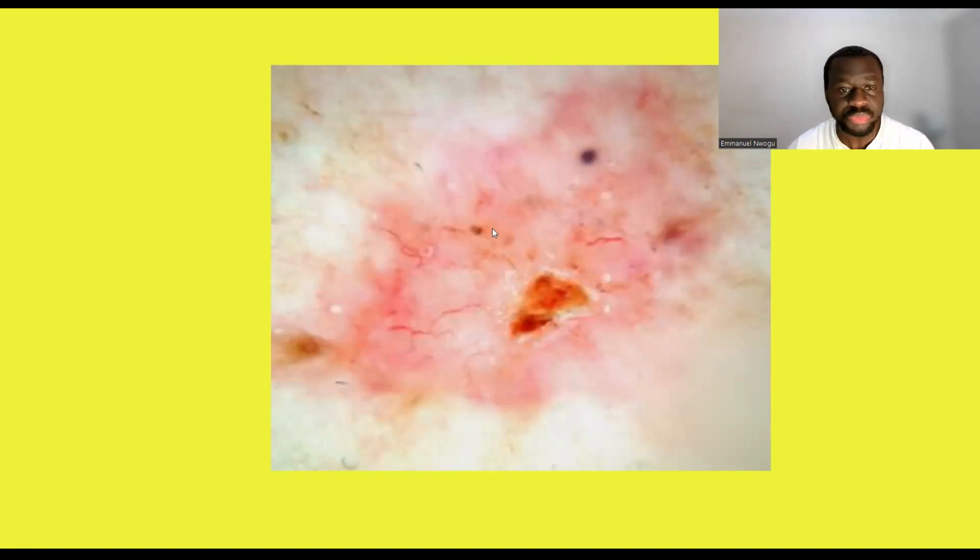Excuse me. This other lesion shows you ulceration. That's a blood clot. That's an ulcerated part of the lesion. You can see so many arborizing, branching blood vessels. You can see this whitish area around, telling you there's ongoing skin tissue destruction and fibrosis. Someone could call that a maple leaf-like area. Well, not clearly, not distinctly a maple leaf-like area.